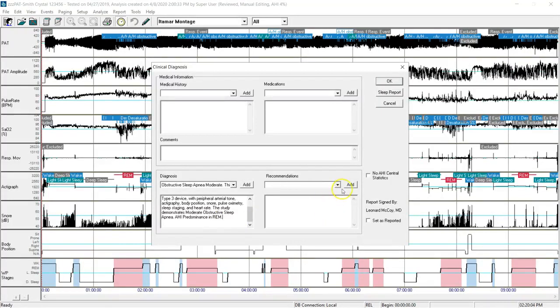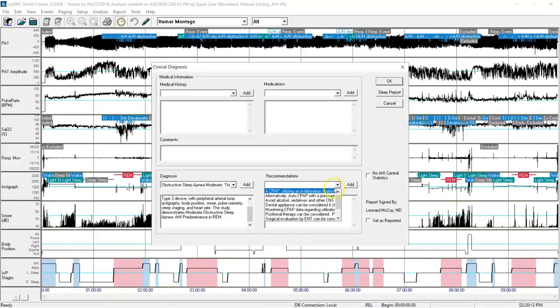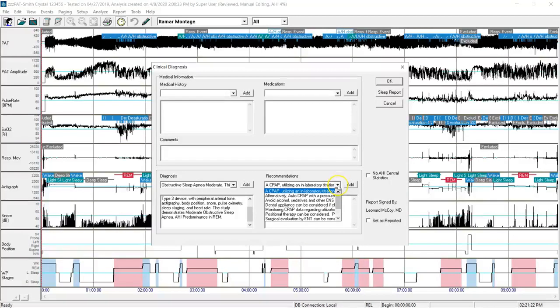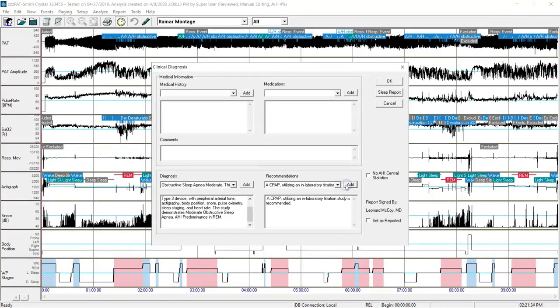I'll then go over to recommendations and click on that down arrow. There are multiple selections that I can make. I'll click on the down arrow for recommendations, and click on my first setting, and click on add. In this case, my first recommendation is an in-lab titration.